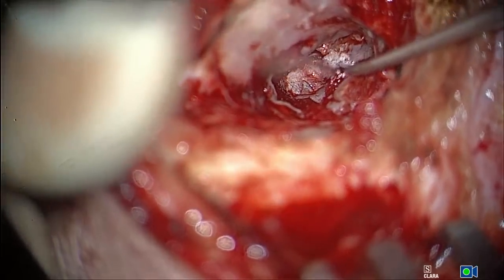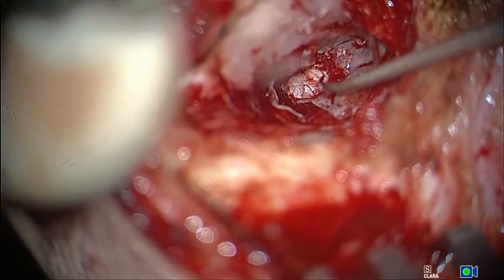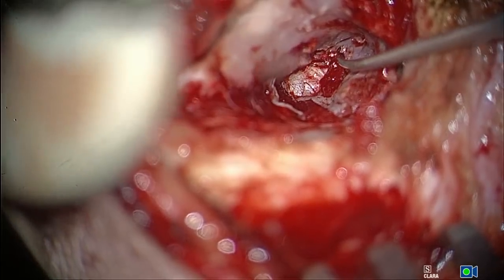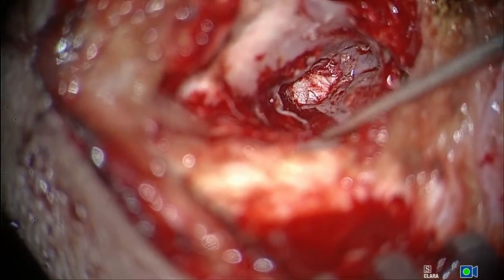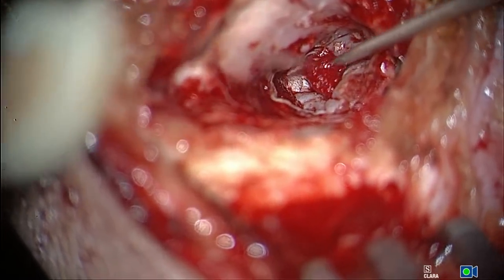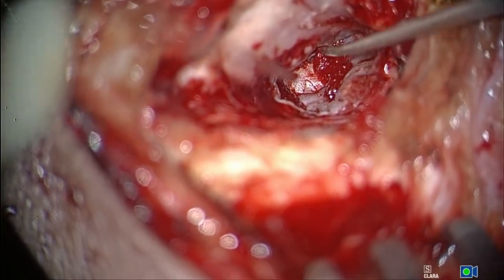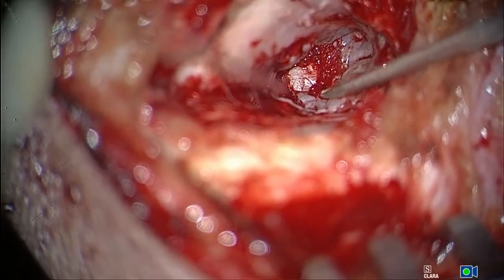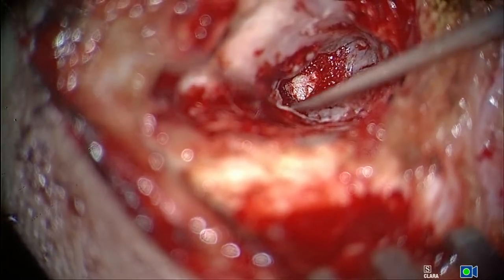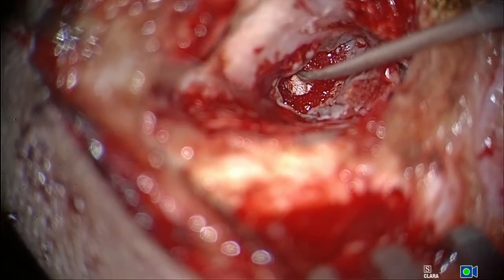I'm not sure how the cartilage works. People talk about the cartilage having the same effect. In fact, I had a few cases coming from various other places, and they had put cartilage, and the patient had around 60-70 decibel hearing loss. He said, sir, I'm not able to hear properly. I had to actually remove that cartilage and put in a temporalis fascia. I don't know how cartilage works as well as the fascia. I really don't know. This is the technique which we follow.